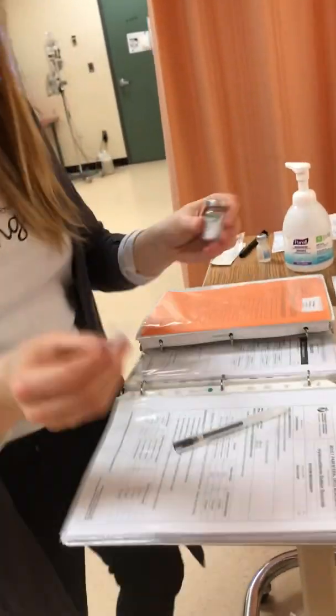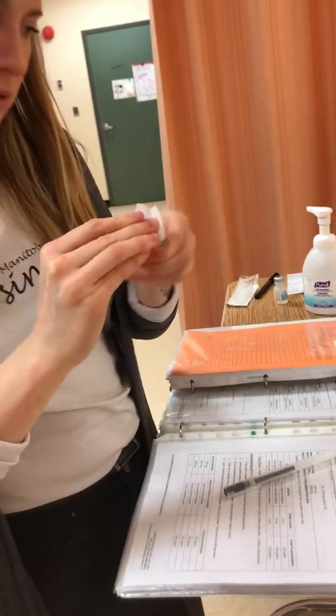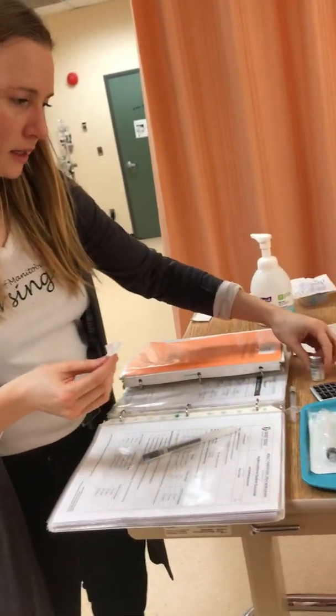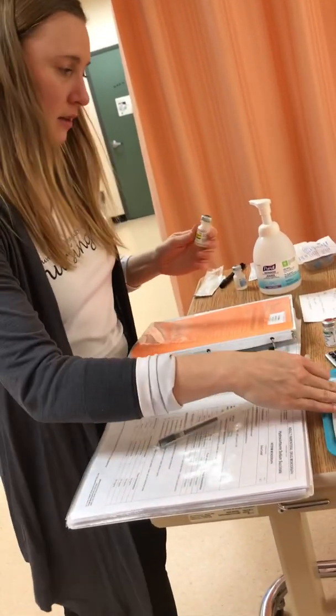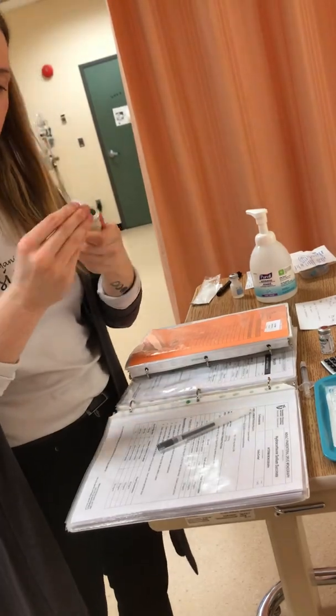At this point, I would re-swab and wait for 30 seconds. And I will also re-swab my sterile water. I will be mixing this in 8.4 milliliters of normal saline. This is not expired.